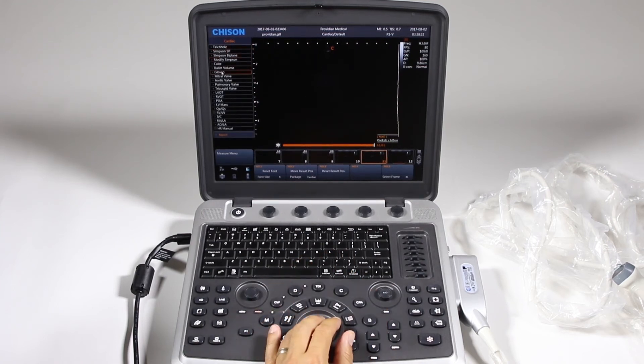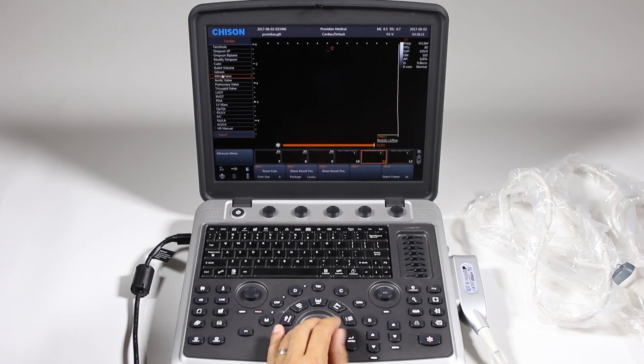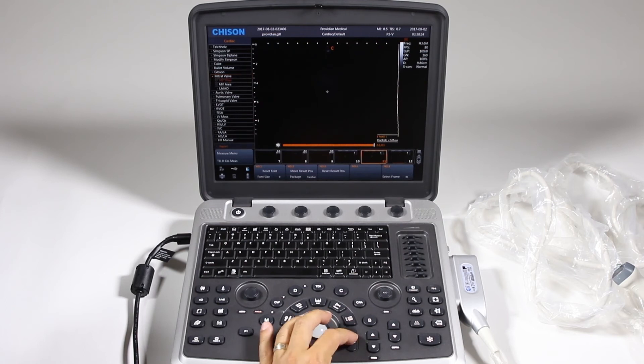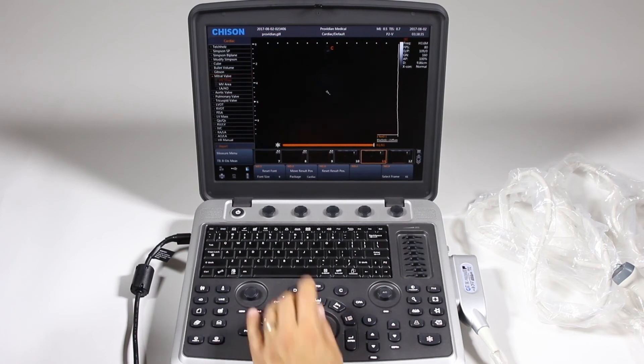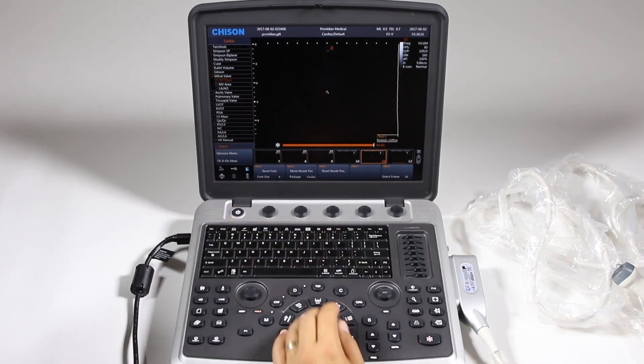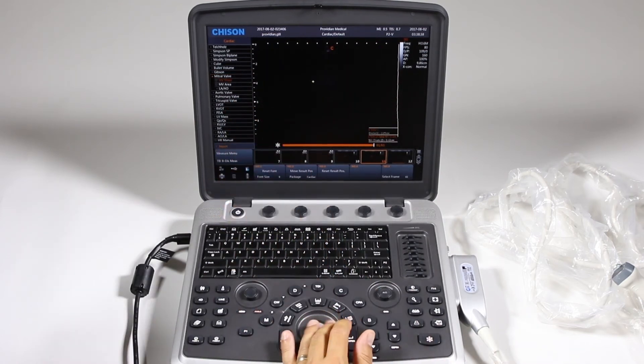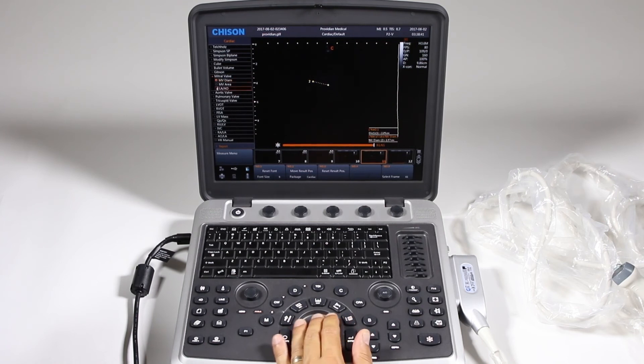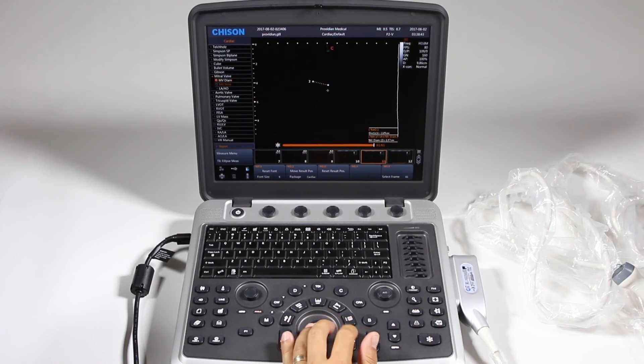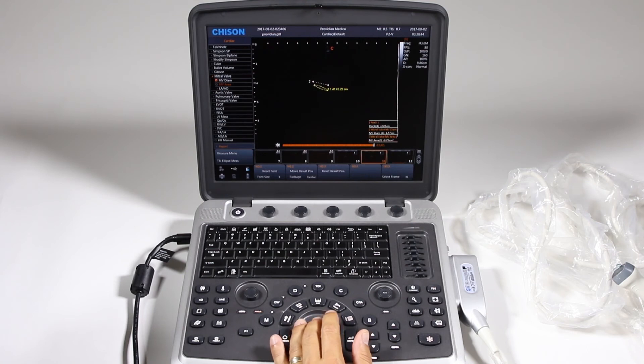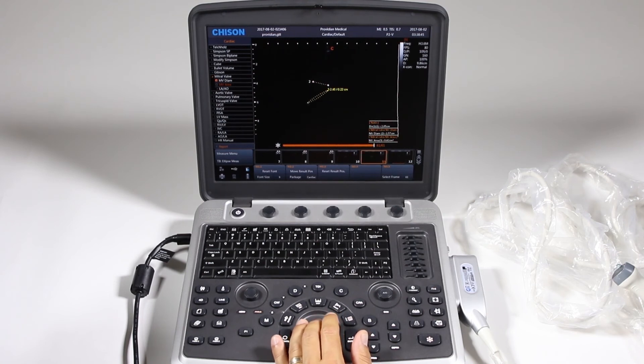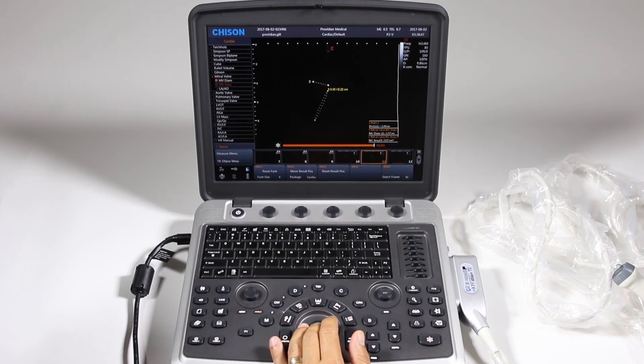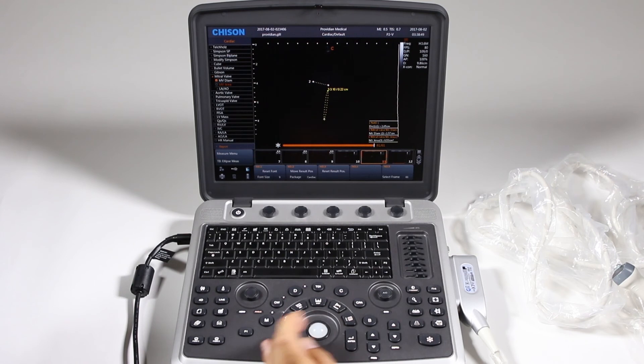To select my measurement, I'm just going to select mitral valve and the first one is automatically highlighted. And I'm just going to take a diameter measurement there. And then I take the arrow and I can choose my area. This one is an ellipse.